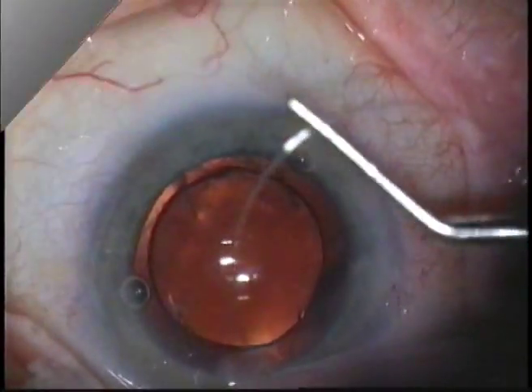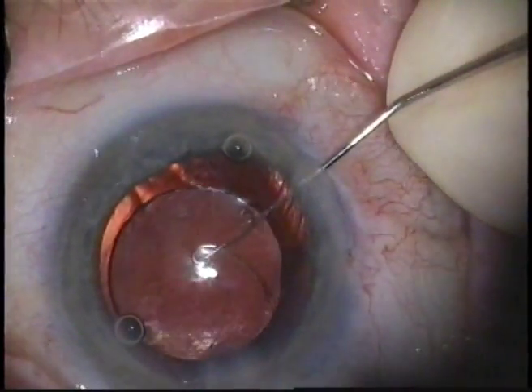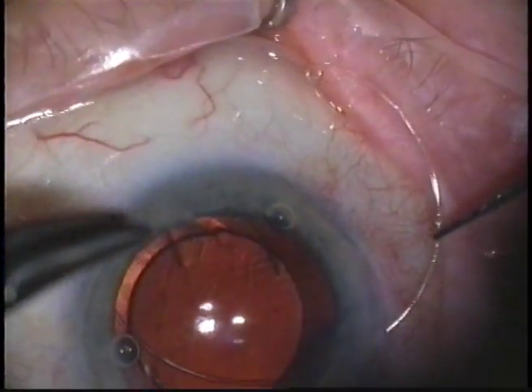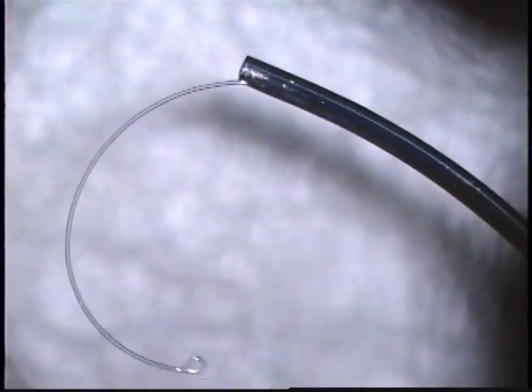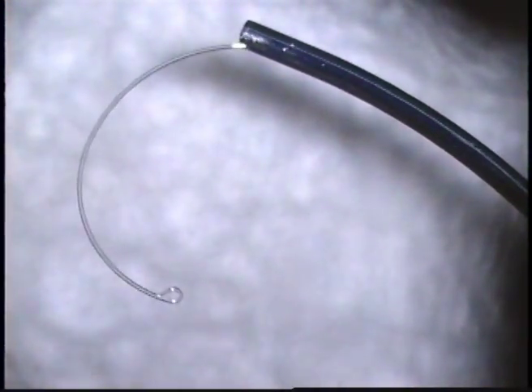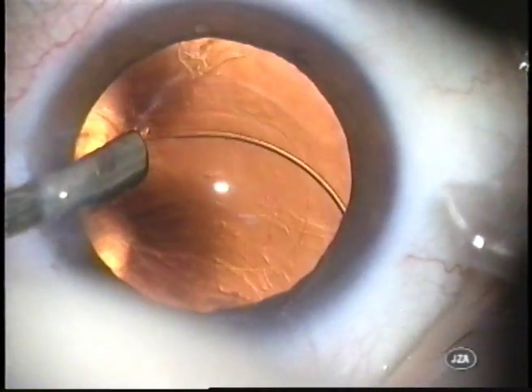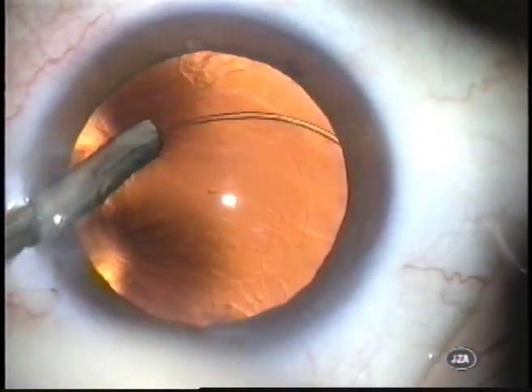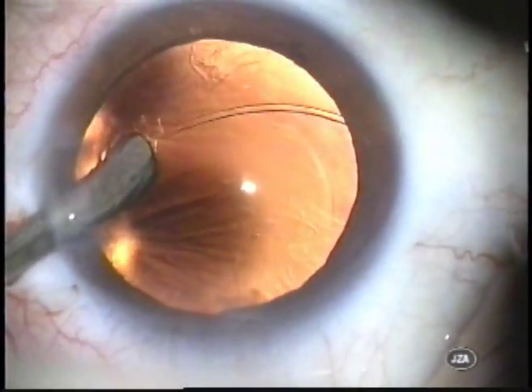Insertion of capsular tension rings may be performed using fine forceps and hooks. These grasp the ring by the terminal eyelets or ring body and dial it in through the capsular opening. Implantation may alternatively be performed using a capsular ring inserter.